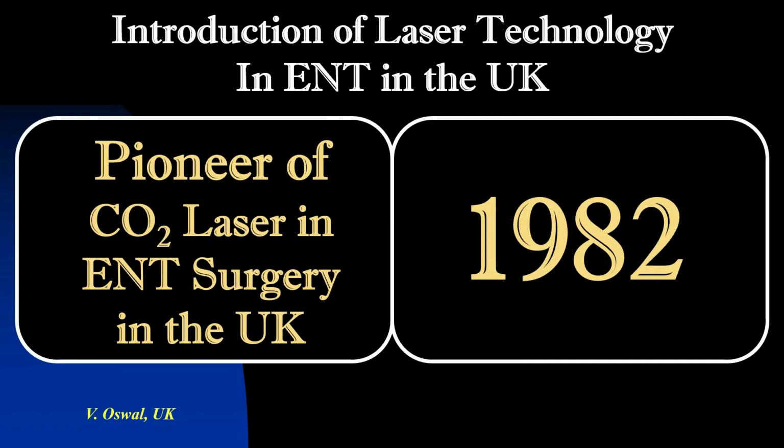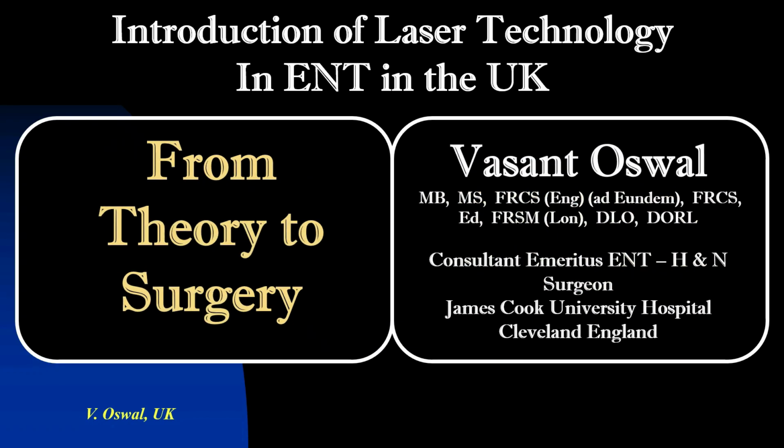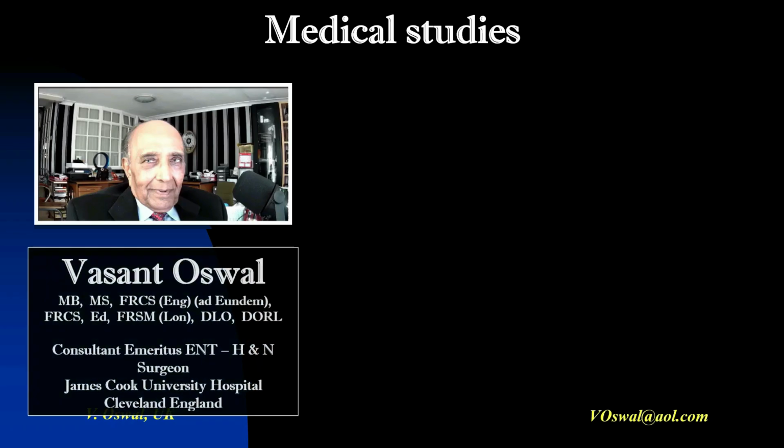This original video recording tells the story of the evolution of the CO2 laser in ENT surgery in the UK in 1982, from theory to surgical, by Vasant Oswal, consultant emeritus ENT and head and neck surgeon, James Cook University Hospital, Cleveland, England. My name is Vasant Oswal.